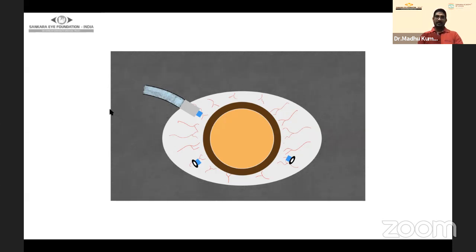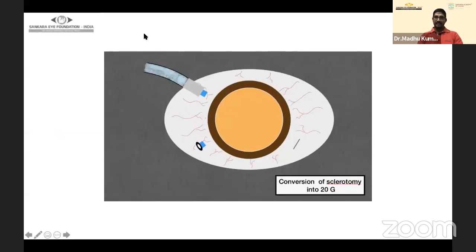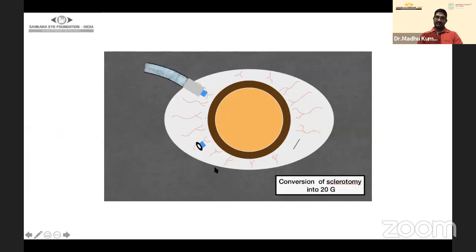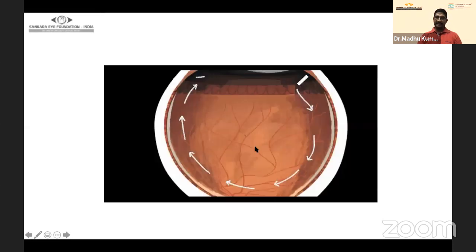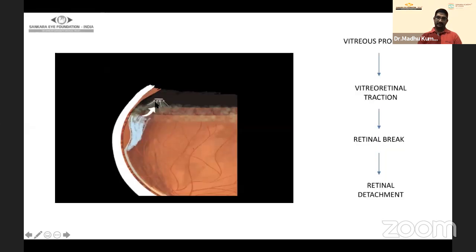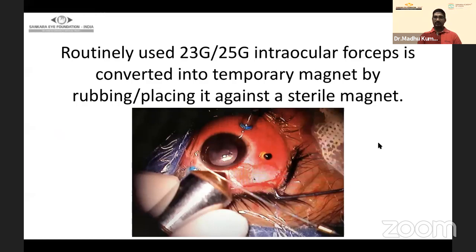This is the classical technique for metallic foreign body removal: magnet in the non-dominant hand, basket forceps in the dominant hand. One sclerotomy is extended if the foreign body is less than 6 mm and can be removed through one of the ports, followed by closure. The problem with this technique is that vitreous follows through the extended port, and peripheral vitreous traction can cause a retinal tear — possibly presenting as retinal detachment weeks, months, or years later.